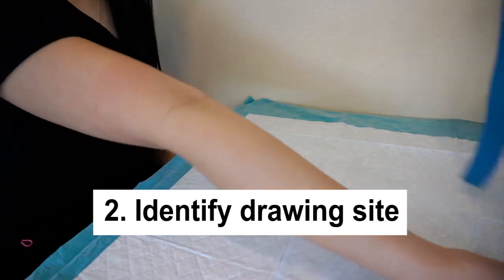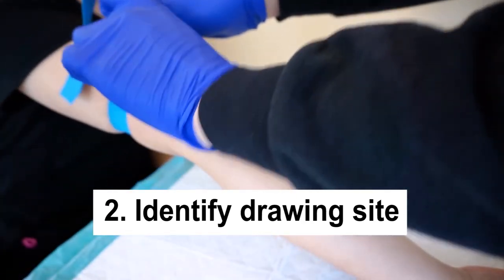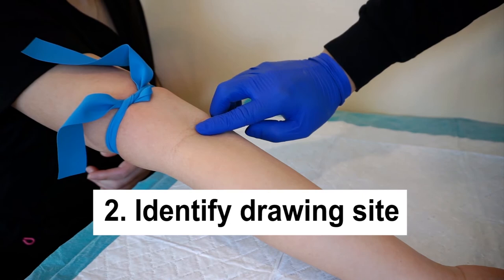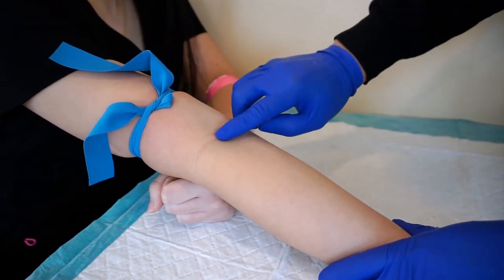Second, identify the drawing site by palpating the patient's vein. Look for a good bouncing vein, not what is visible by the eye. Start looking for the vein from the antecubital site, generally located at the bend of the elbow.